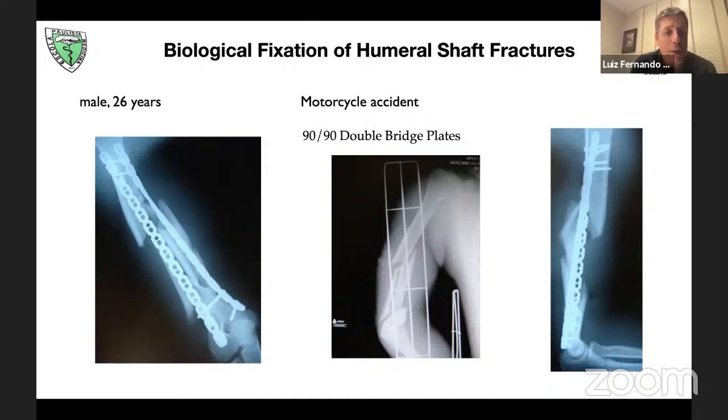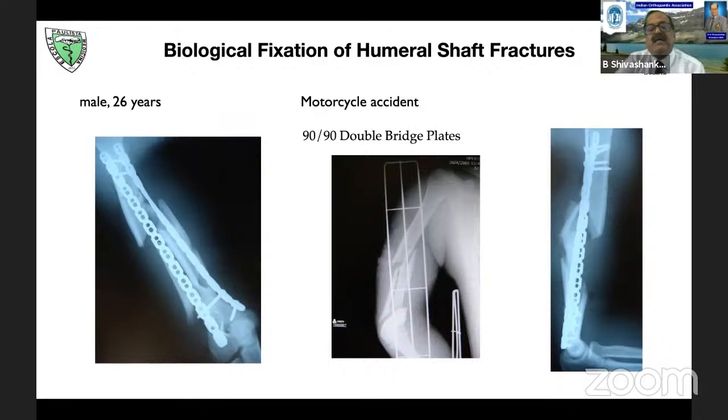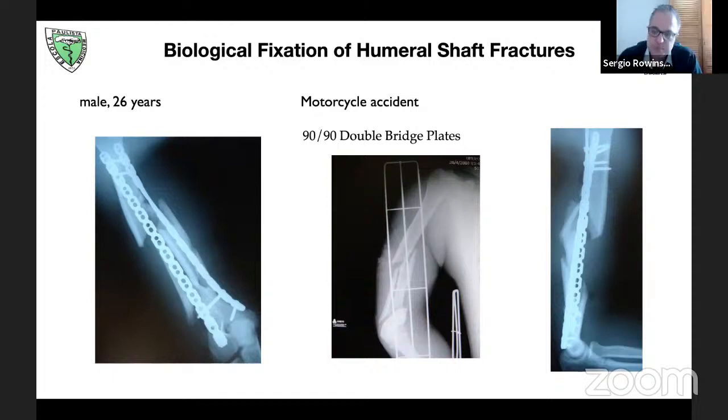Dr. Shiva, what do you think? It will work or not? Yes, definitely it will work. This is a biological way, you have preserved as much as possible the biology. And I'm happy with this, but my friend Sergio would have definitely done an anterior bridge plate. This fragment is big enough. I can see in the left side picture, the first picture, that the fragment is good enough to hold 2 screws. Yes.